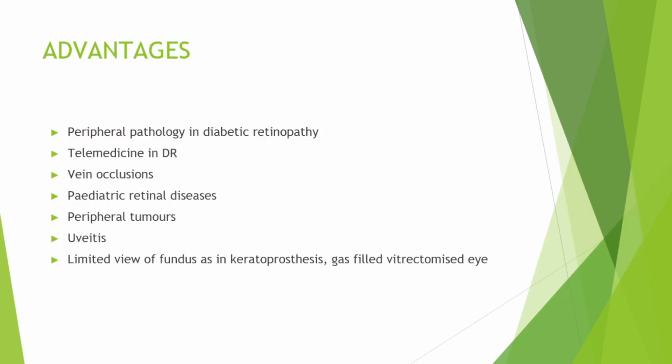The advantages of wide field FFA include that it can view the peripheral pathologies, such as peripheral vascular leaks in diabetic retinopathy, which can be missed. Findings in the periphery in all the other diseases can be seen, like vein occlusions, pediatric retinal diseases, peripheral tumors, uveitis, etc.